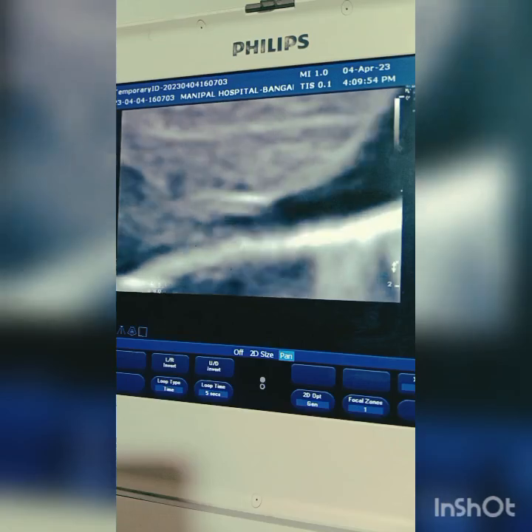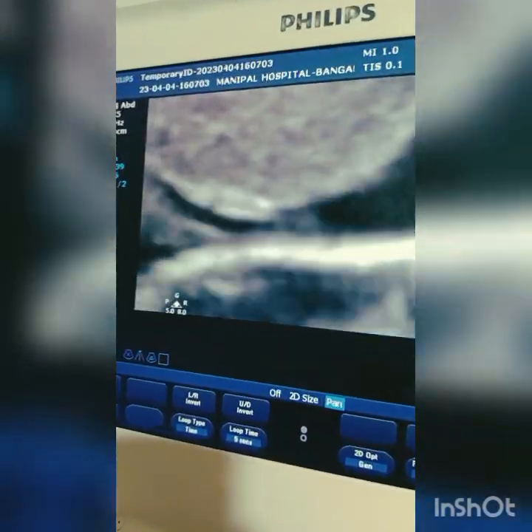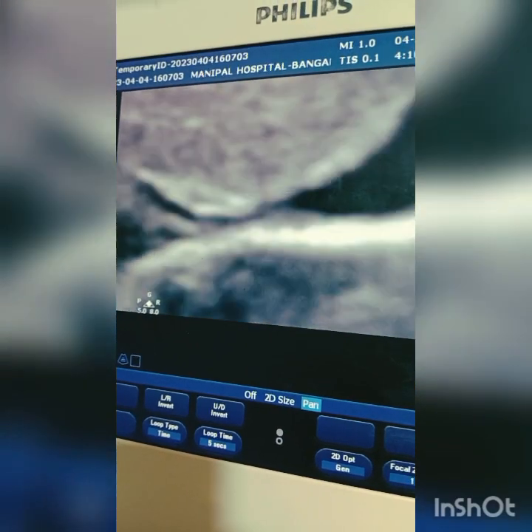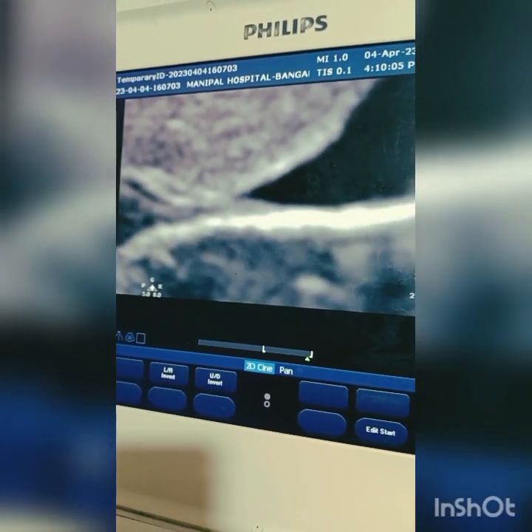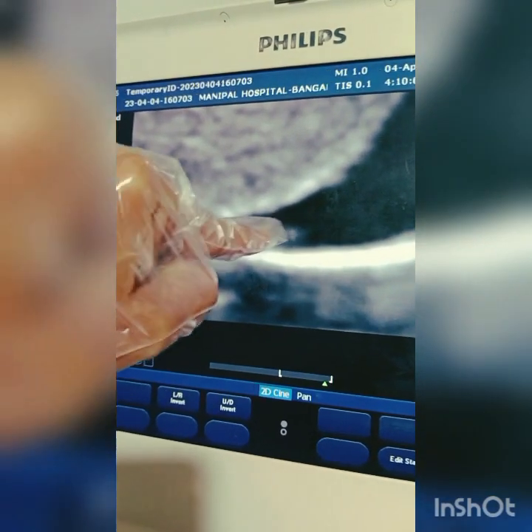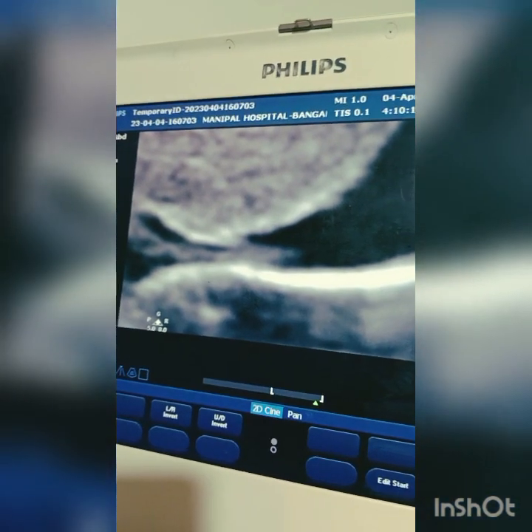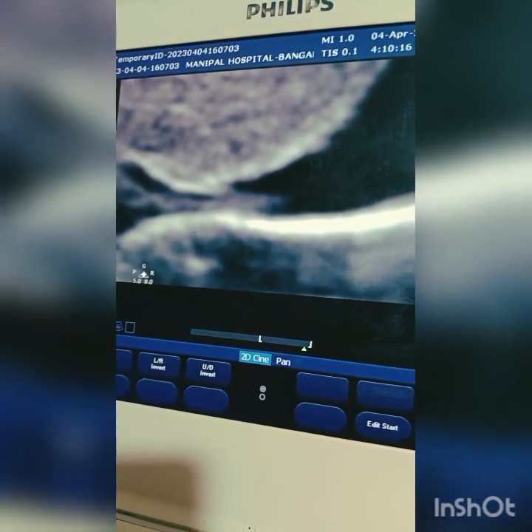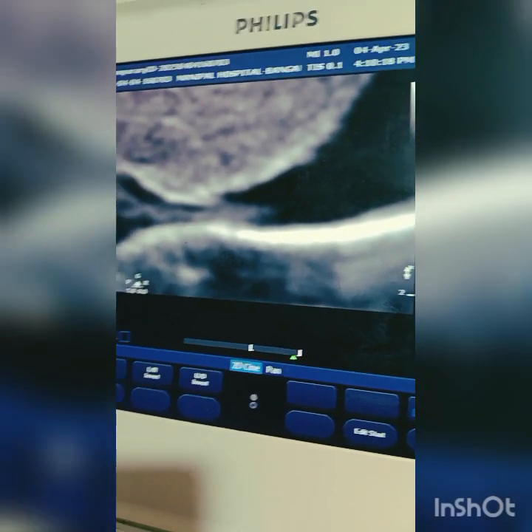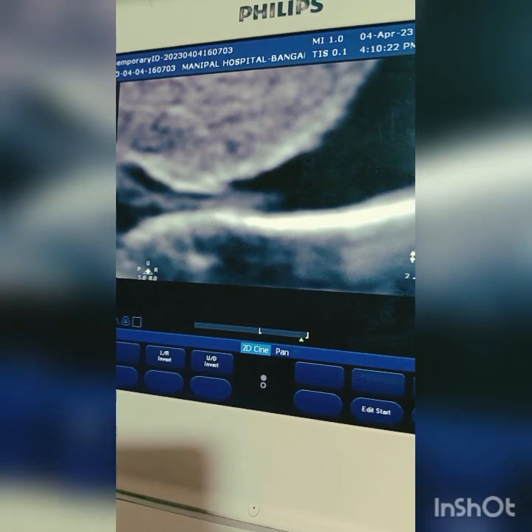Successfully placed at the junction. I'll freeze the image to show you. You can see the panel — the junction. Be careful that the tip should be monitored every day, as migration further inward is one of the important causes of cardiac tamponade. Make sure the line does not migrate further forward.